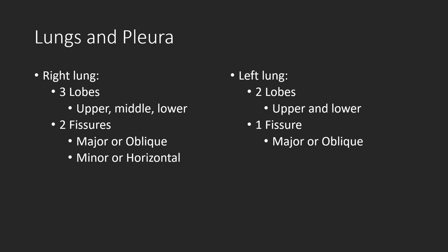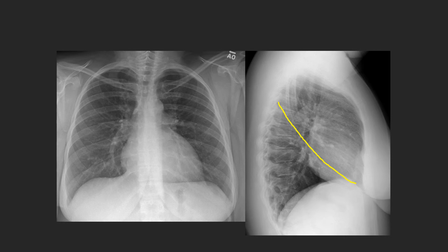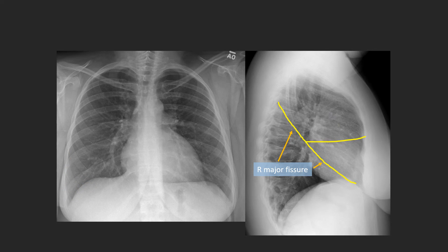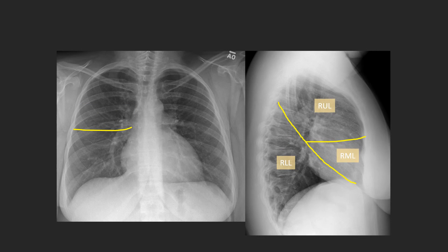The right lung has three lobes — upper, middle, and lower — separated by two fissures: the major or oblique, and the minor or horizontal. The left lung has two lobes, upper and lower, and one fissure, the major or oblique. The right major fissure is easy to see on the lateral view but typically not seen on the frontal view due to its oblique orientation. The right minor fissure arises anteriorly from the major fissure with a very horizontal course and can sometimes be seen as a thin line on the frontal view. The right upper lobe is anterior and above the minor fissure, the right middle lobe is below the minor fissure and anterior to the major fissure, and the right lower lobe is the most posteriorly located.